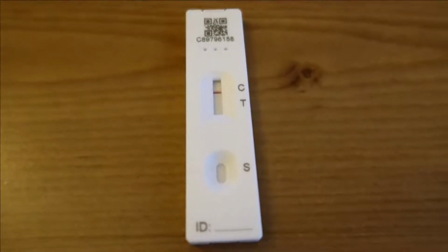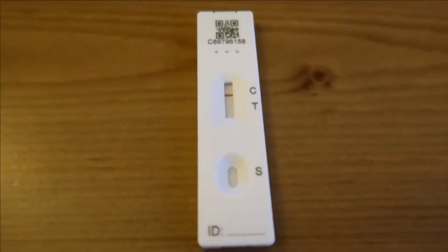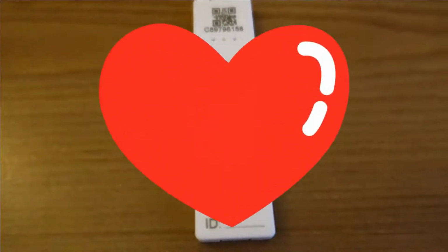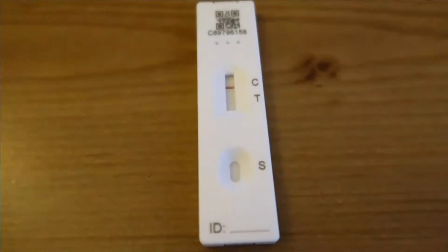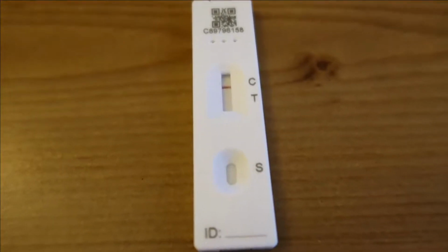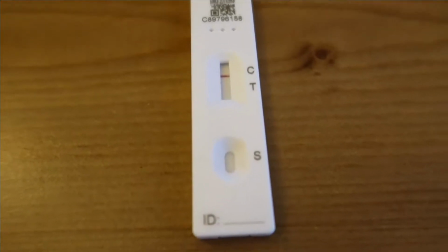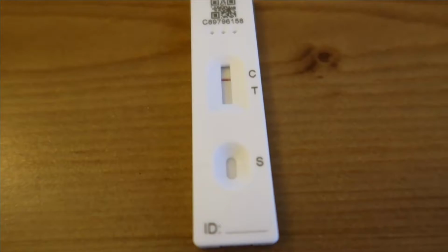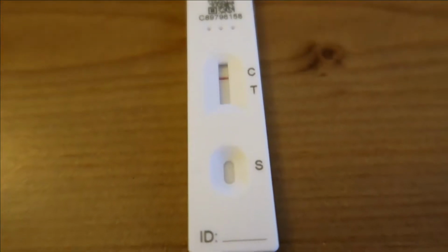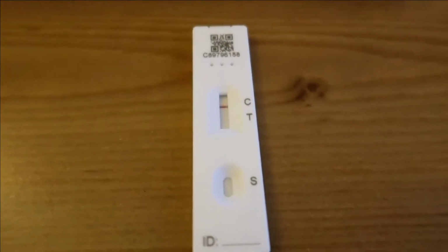So that's our result. I'm negative for my home test. I'm also not showing any symptoms. I don't have cough, I don't have fever, I'm not feeling unwell at the moment. So I'm 90% sure. I'm confident that when I go to work, I'm not positive at all, so I'm not going to pass anything to my colleagues. That's the most important thing.